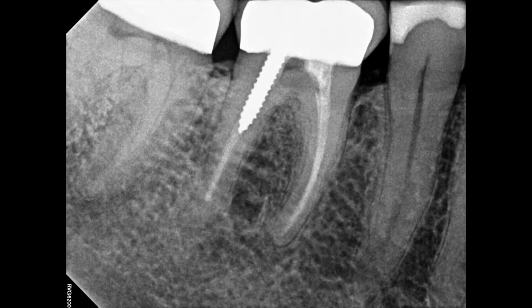Great. So tell us about some of your memorable clinical cases that you've had recently. I brought a few examples along to demonstrate. In this initial intraoral radiograph exposed with an RVG 6200 sensor, the mandibular right first molar shows previous endodontic treatment. The only hint of a lesion is the slightly irregular trabecular pattern associated with the distal root, but no associated discontinuity of the periodontal membrane.